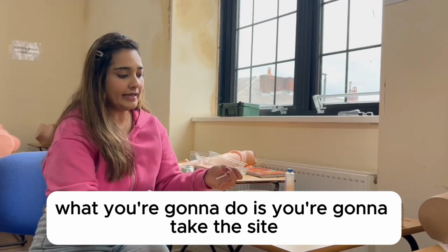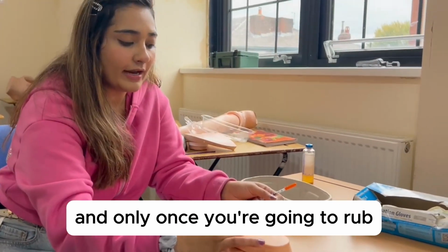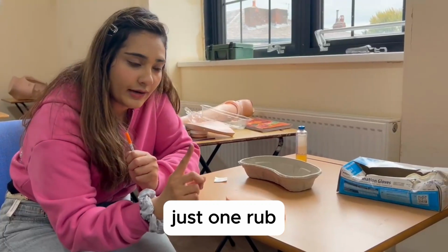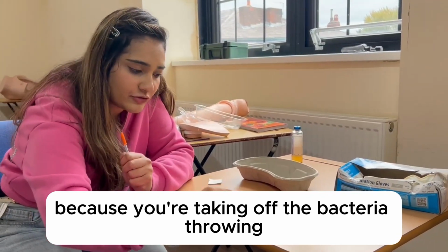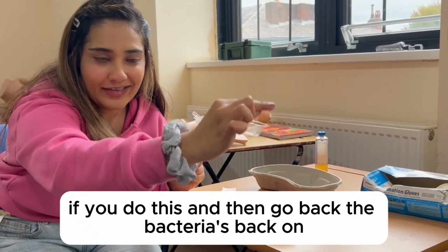What you're going to do is take the site. As you can see, this is our site. You're going to open the alcohol swab, and only once you're going to rub, and throw it in the waste bin. Okay, just one rub. Make sure you're not rubbing it back and forth, because you're taking off the bacteria and throwing. If you do this and then go back, the bacteria is back on. So don't do that.